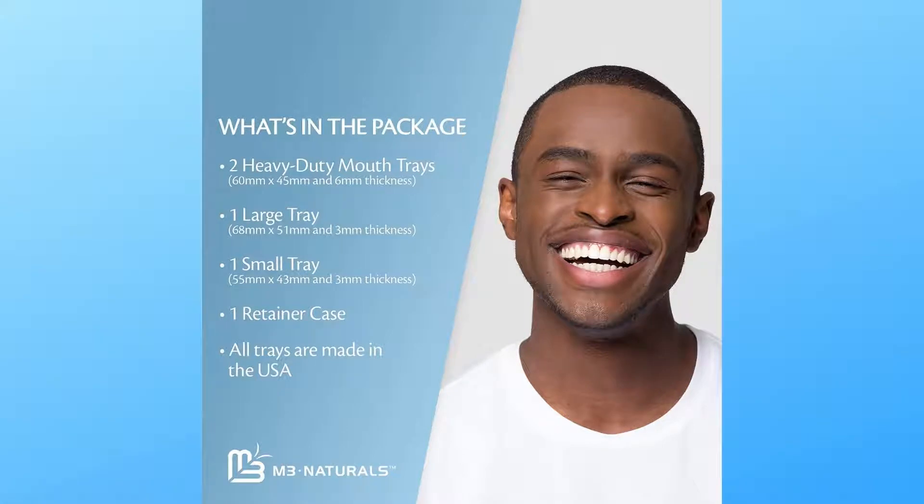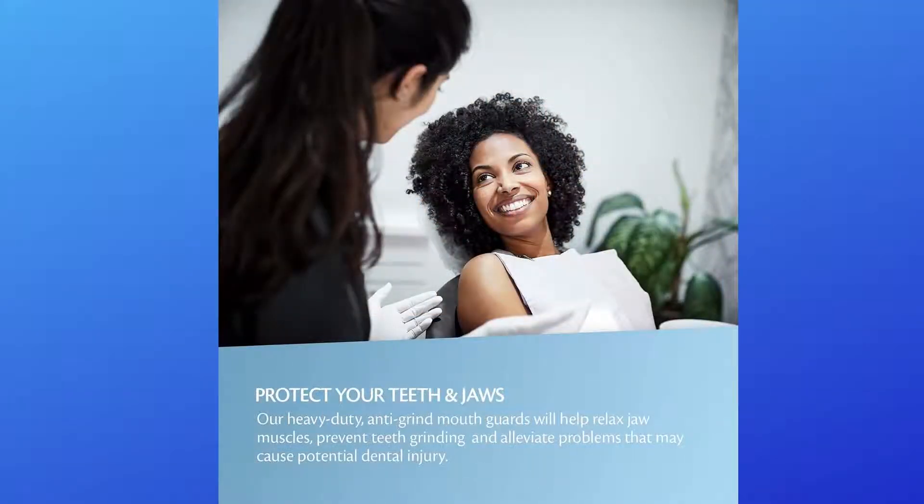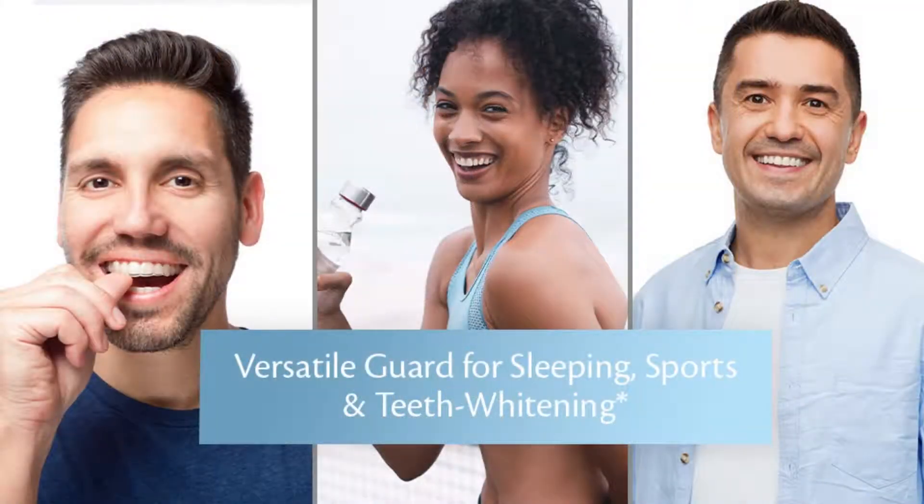Versatile and heavy-duty, M3 Naturals offers the only heavy-duty option and includes a retainer case. With 4 guards and 3 sizes, you will certainly find the fit that works best for any purpose — teeth grinding, athletic sports, mouth guards, or even as a teeth whitening tray.